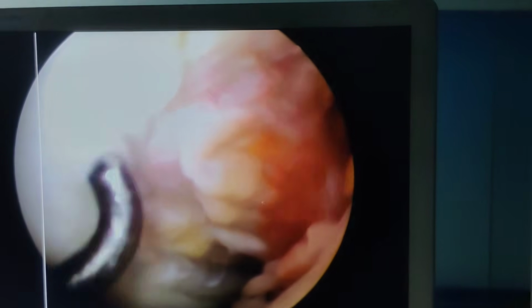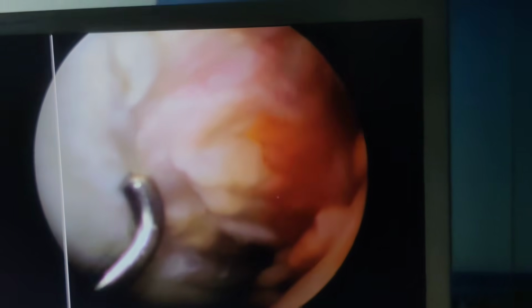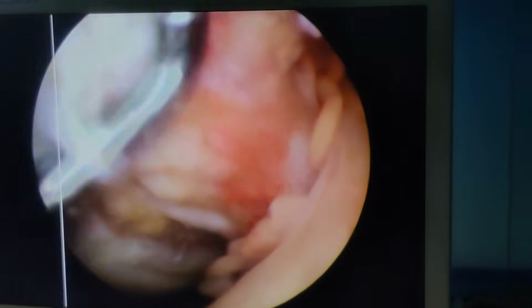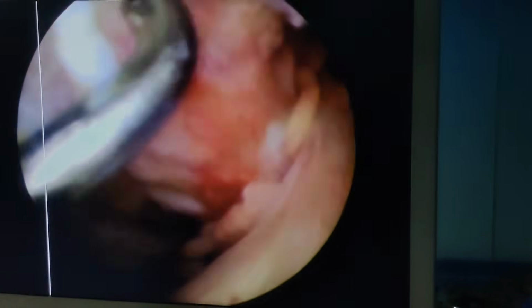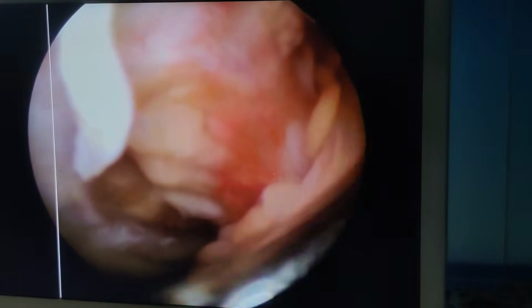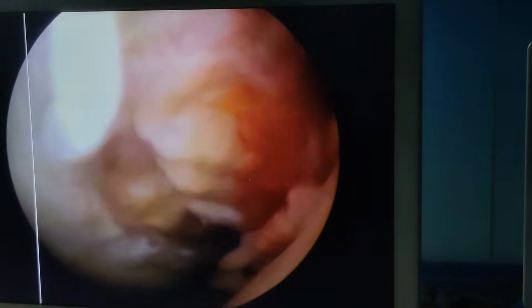Just to orient you, this is the articular surface of the medial femoral condyle. This is the lateral aspect of the medial femoral condyle. This is the attachment of the PCL. So this is coming in the way. Let me just shave this so that it doesn't bother me when I am explaining to you.